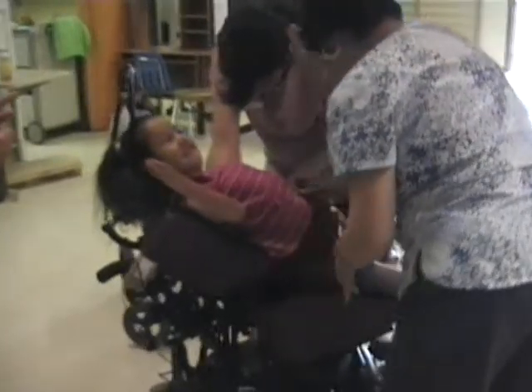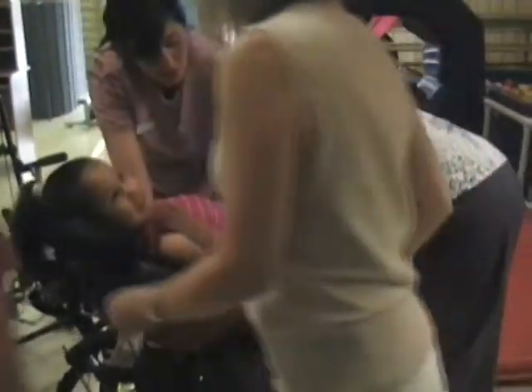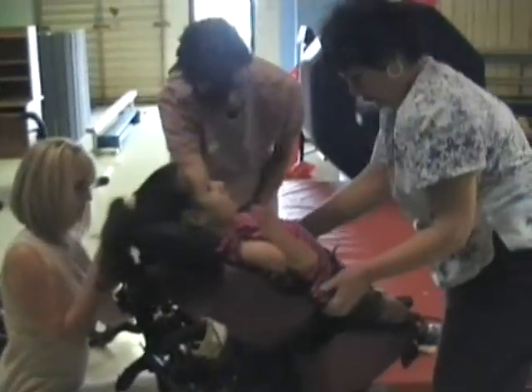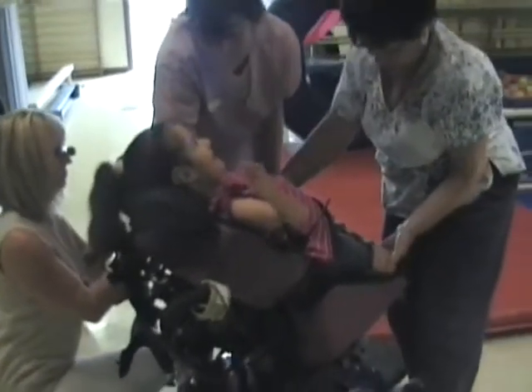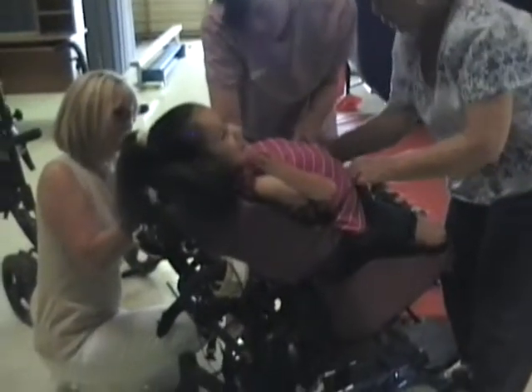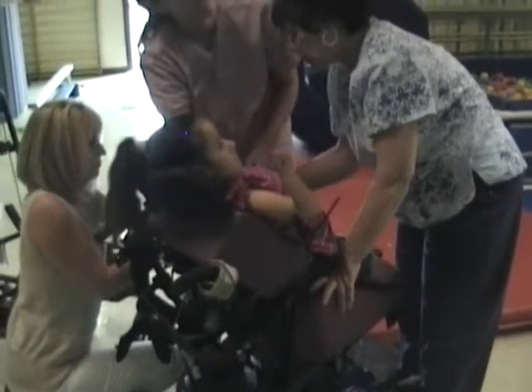Apparently we have a problem. There you have Ariana's team of OT and PT staff trying to position her in her wheelchair so she can do her power training. She'll do approximately 30 minutes of training in the power chair — starting, stopping, whatever she needs to learn.